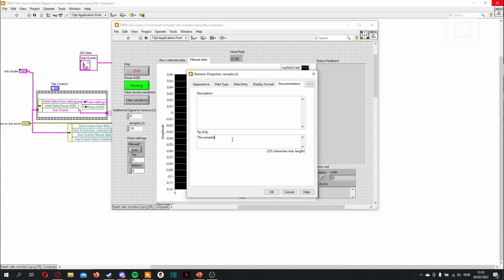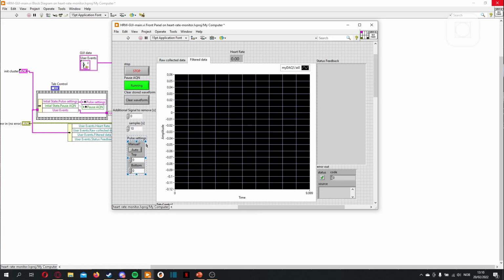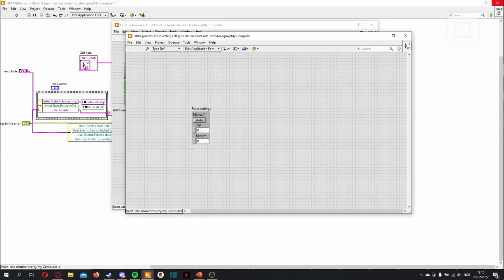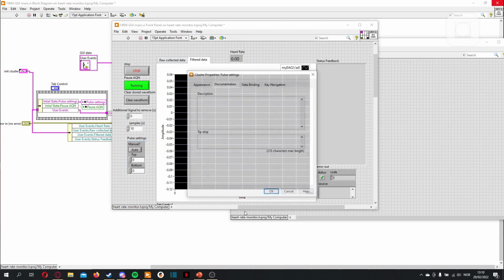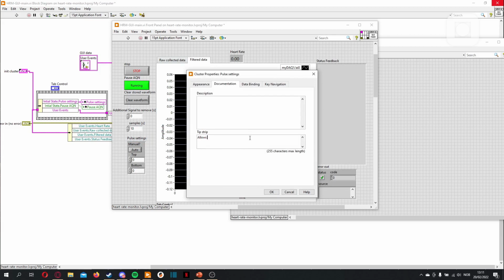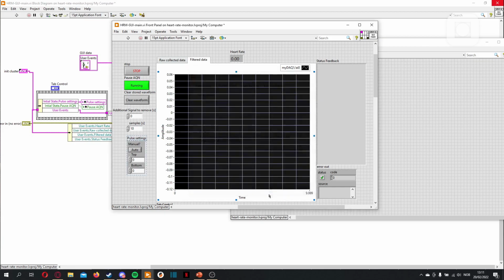The sample size in seconds. So here we should go into the type def to explain each button, but we can have one for the whole thing and then one for each button. So let's start with the whole thing. Allows the user to choose between automatic detection of the pulse frequency or doing it manually. Okay, that's that.